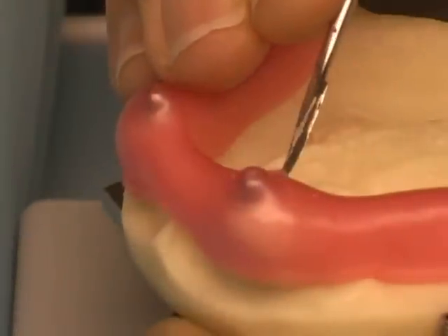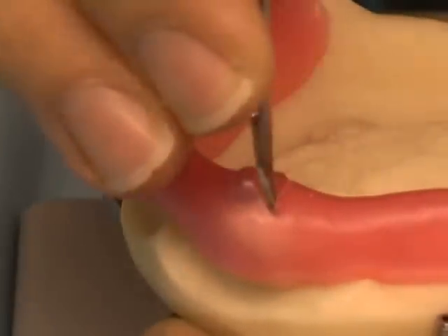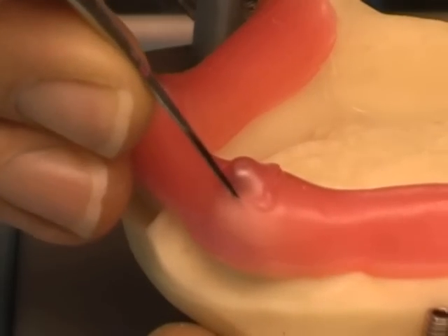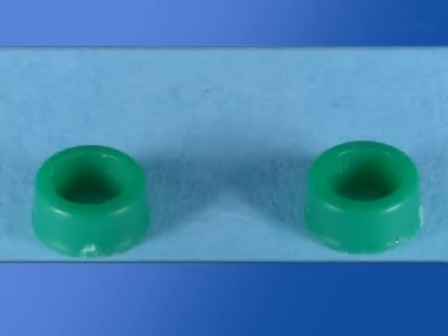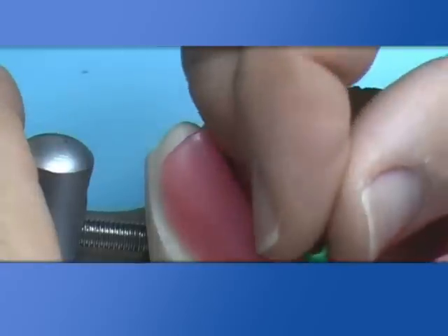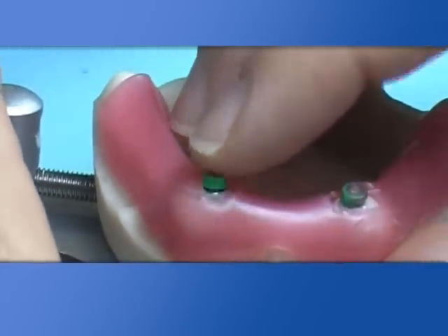The thin wax base needs the right thickness in order to allow curing of cast components inside the denture. It's important to have precision in the positioning rings in order to obtain the exact position of the metal cast boxes.